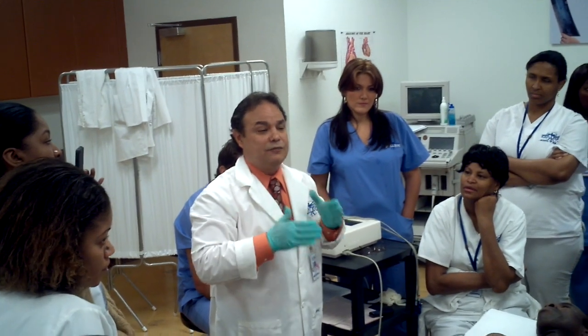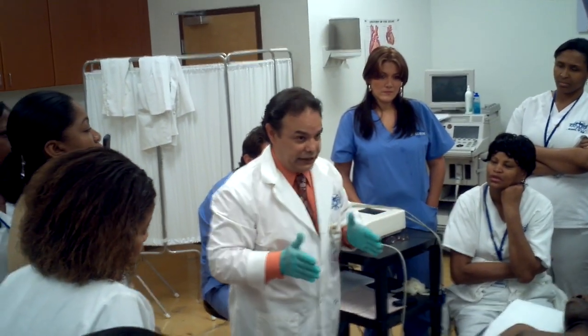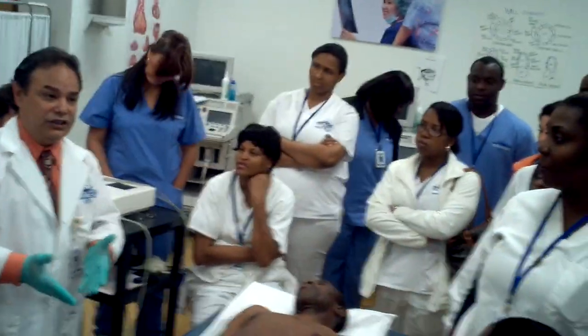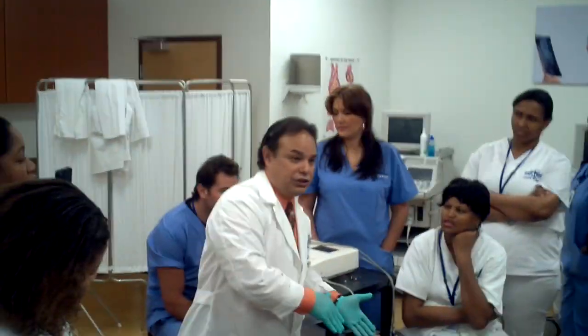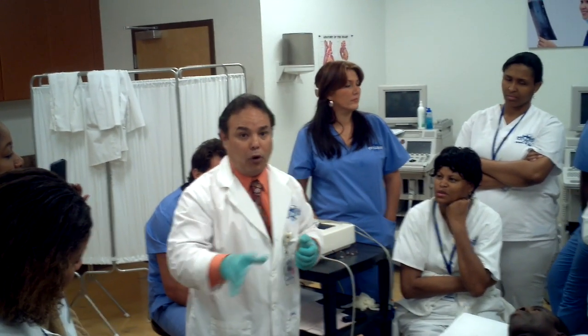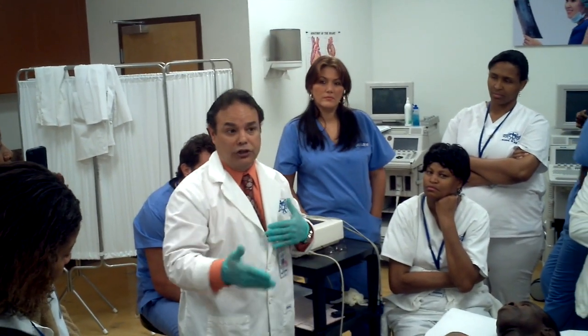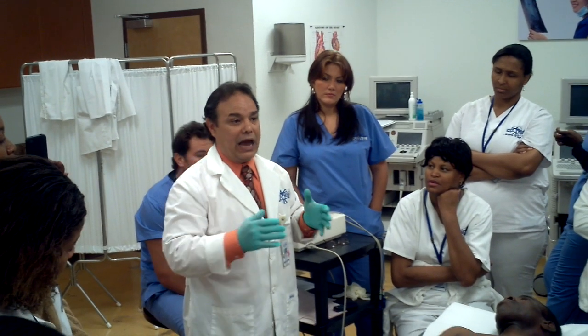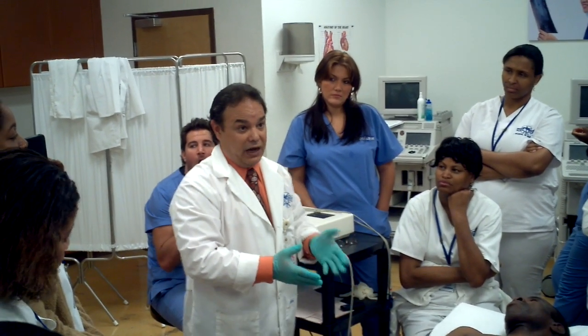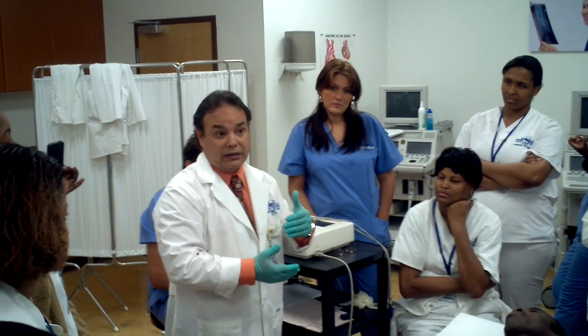The QRS complex represents ventricular depolarization. What happens is the heart is negatively charged and all of a sudden changes its charge to positive — so you are depolarizing. The pole was negative, now it's positive, so you depolarize it. Now it has to go back to being repolarized again, because if not, how are you going to depolarize it on the next beat?